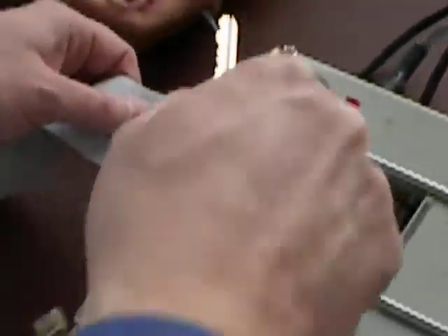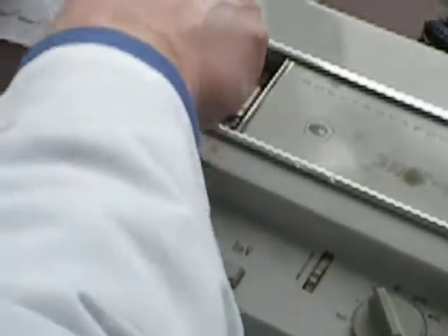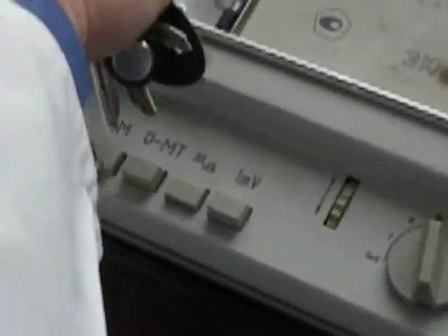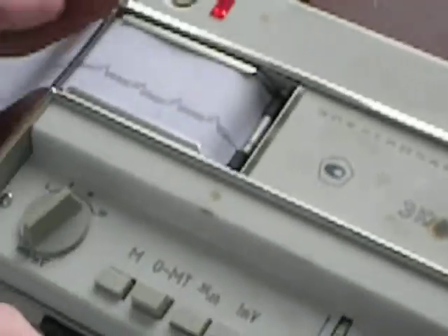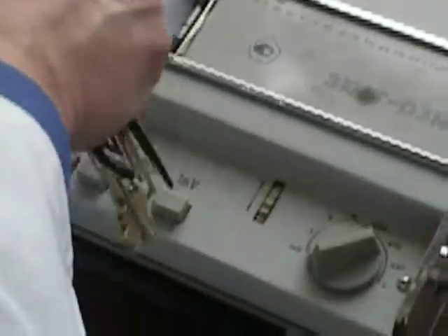And now let's move to the first standard lead. First standard lead. Second standard. First standard. Second standard. AVL. AVF.